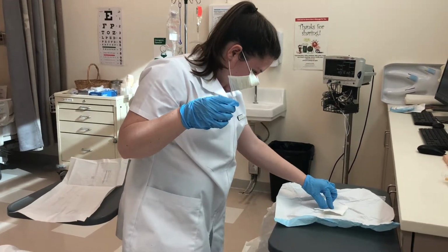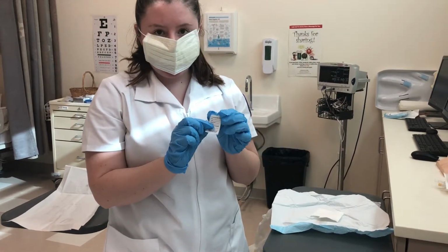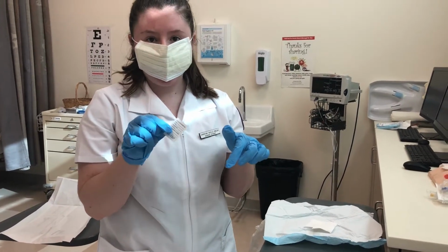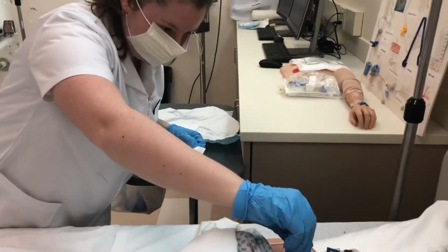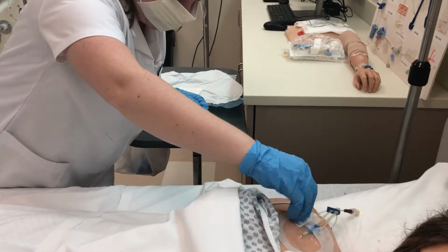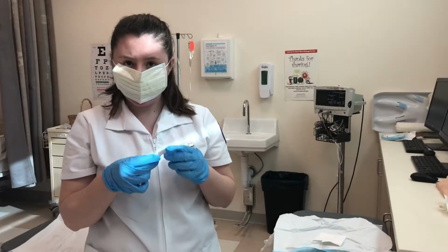The last thing I will do is on this piece of paper, I'm going to put the expiration date of the wrapping, my initials, and the date and the time that I put the new dressing on. And I'm also going to make sure it's not over the clear portion because I want to make sure that the site is able to be seen if there's any signs of infection going on.